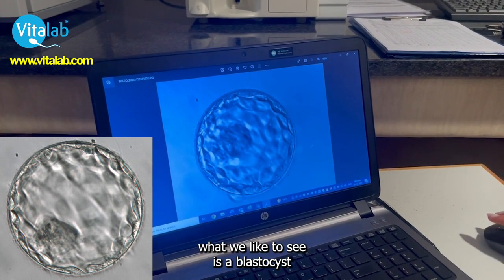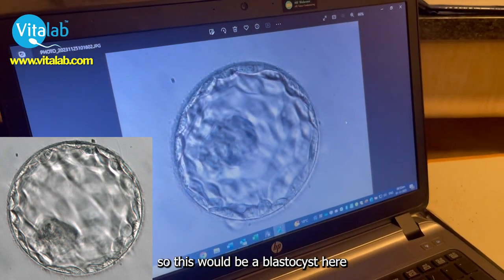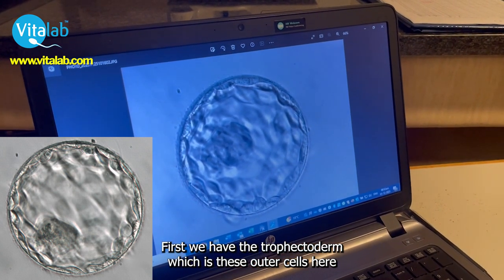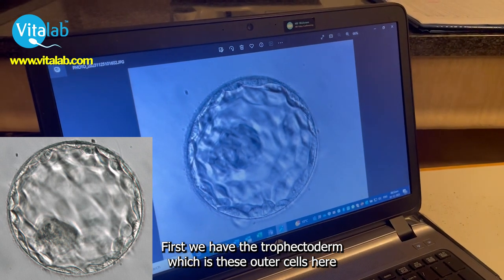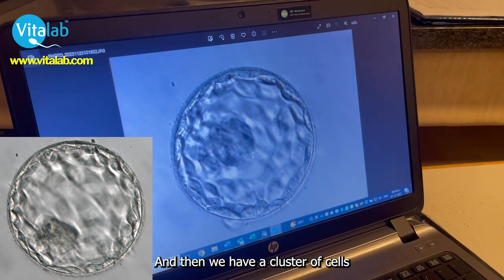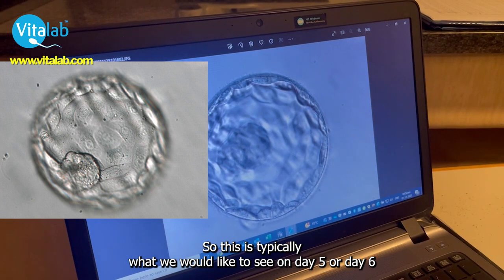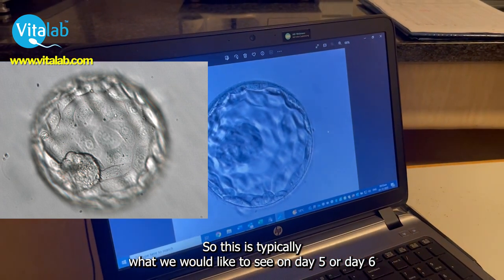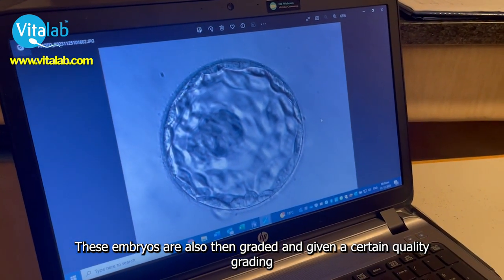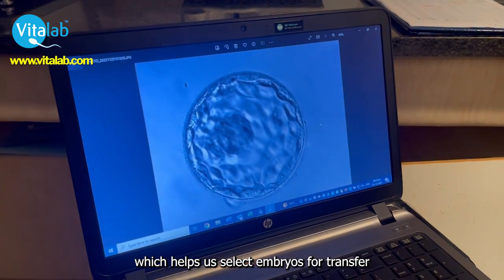Then on day five, what we like to see is a blastocyst. This would be a blastocyst here. There are two differentiations of cells: first we have our trophectoderm, which is these outer cells here — this will create the placenta during pregnancy. And then we have a cluster of cells here called the ICM, which will create your baby. This is typically what we would like to see on day five or day six. These embryos are then graded and given a certain quality rating, which helps us select embryos for transfer.